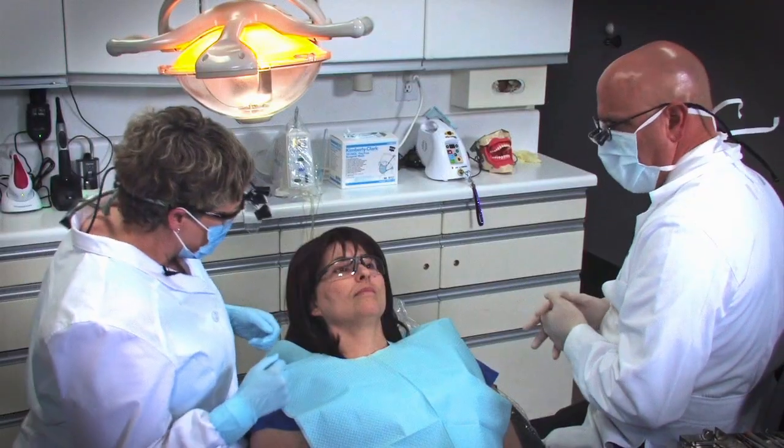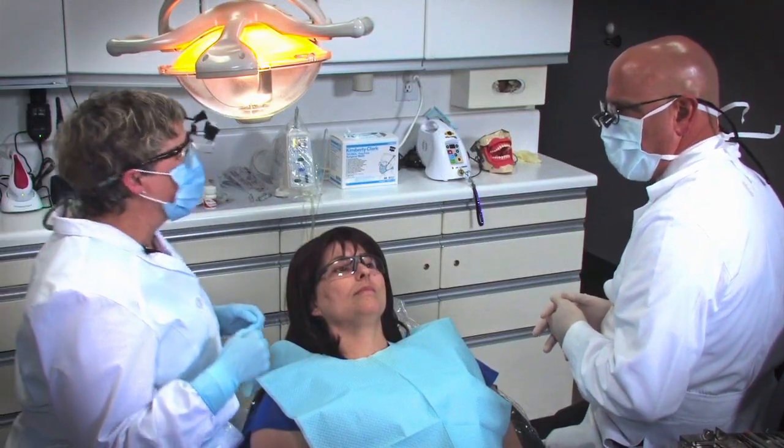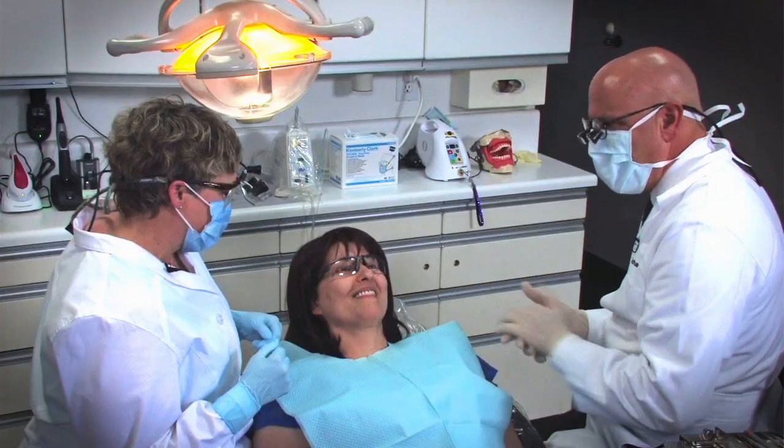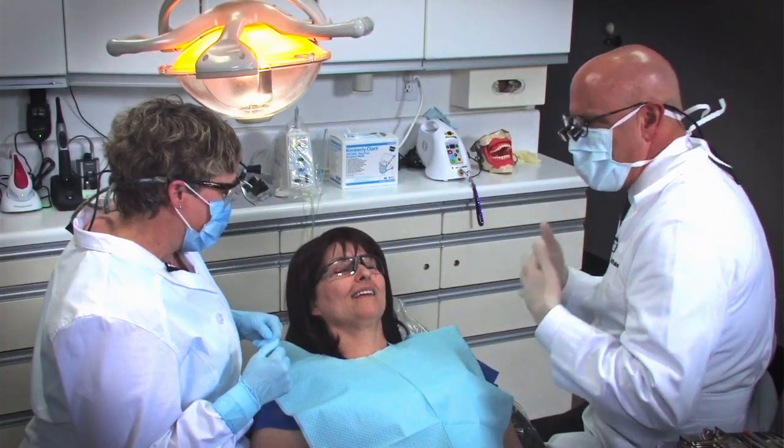All right, Kathy, well, the time is finally here. You're going to walk me through my first Gow-Gates. And let me say, before we get started, that Dr. Murasan, who graduated from dental school this year and had tuition costs — I'm just going to guess over $250,000, a quarter of a million dollars — and didn't learn the Gow-Gates.